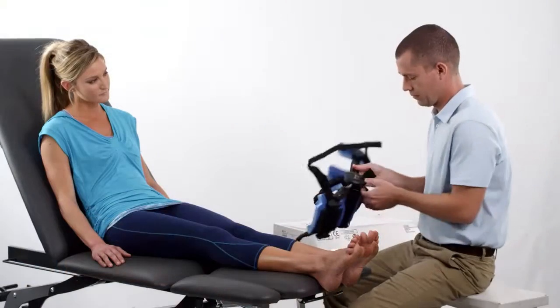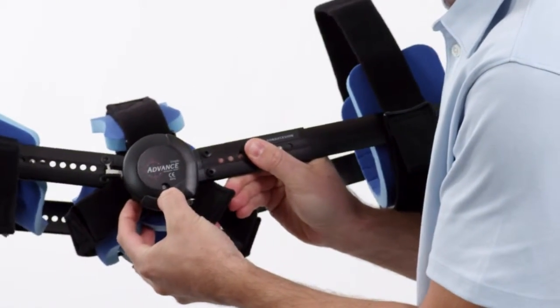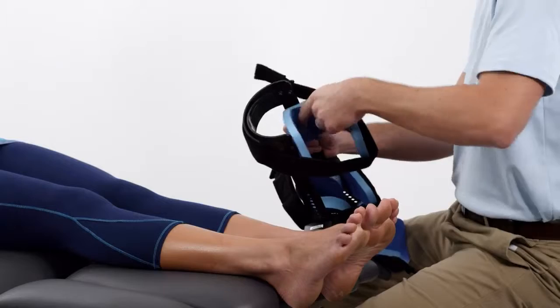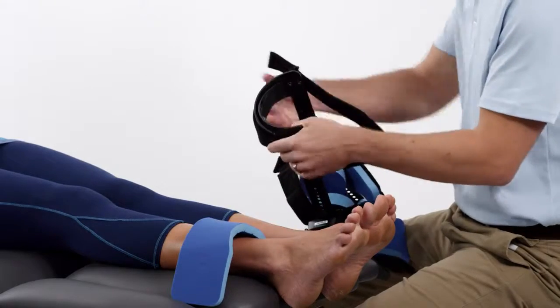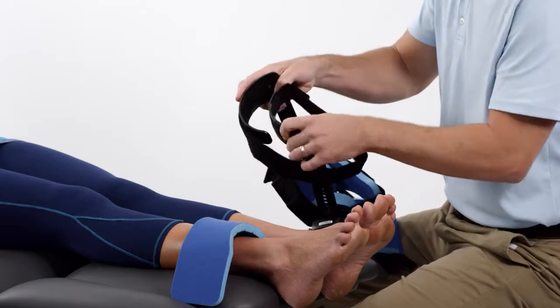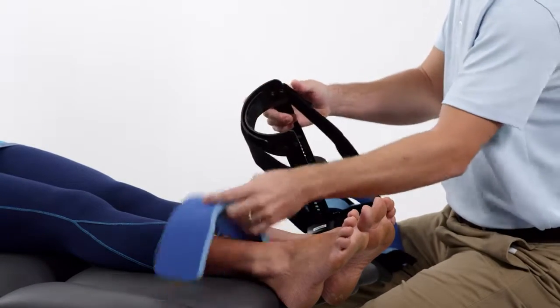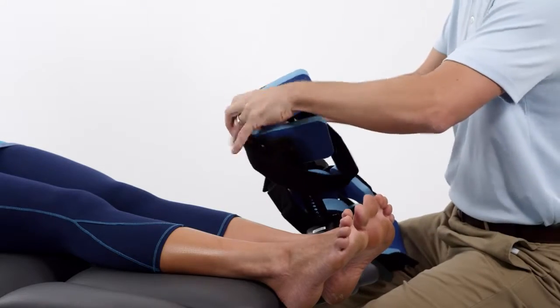Then check the tension control indicator on both tension springs and make sure they are set at 0. Next, separate the foam pad from the contour cuff. Expand the cuff slightly to fit the calf and reattach the foam pad to the cuff.